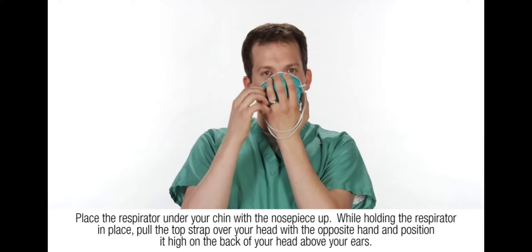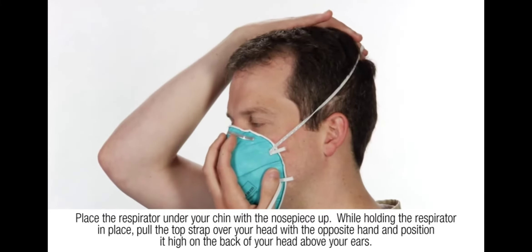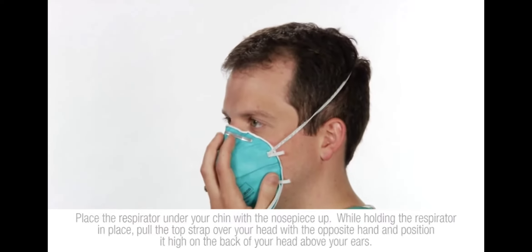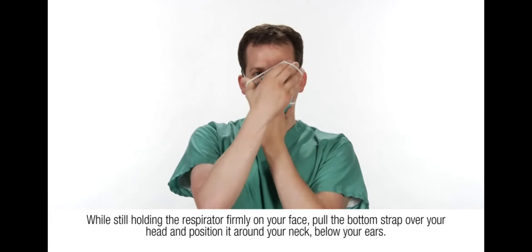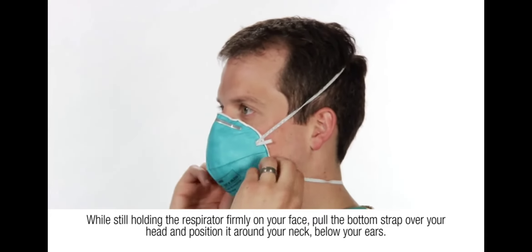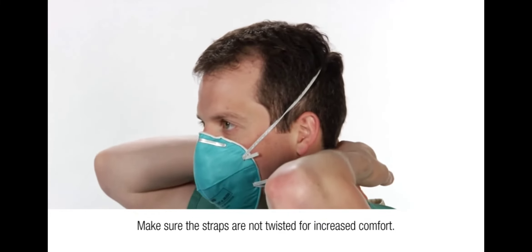While holding the respirator in place, pull the top strap over your head with the opposite hand and position it high on the back of your head, above your ears. While still holding the respirator firmly on your face, pull the bottom strap over your head and position it around your neck below your ears. Make sure the straps are not twisted for increased comfort.